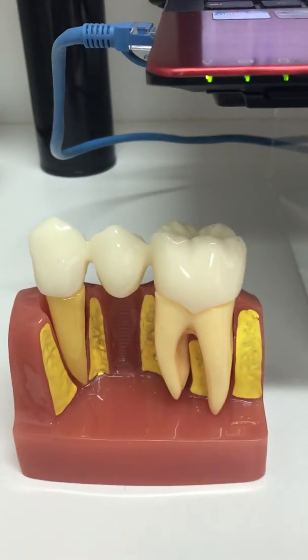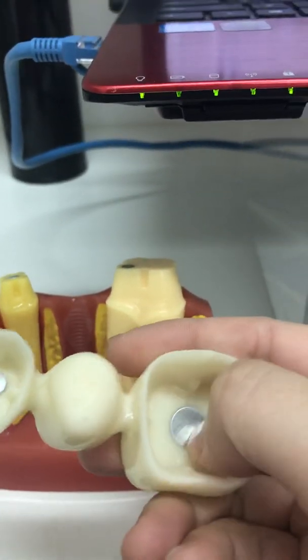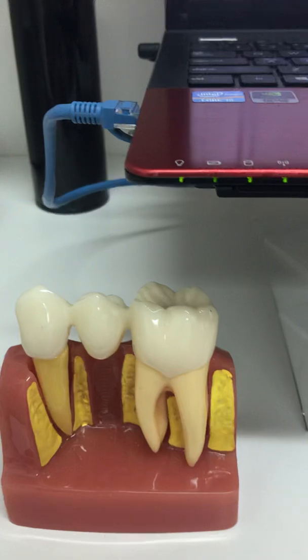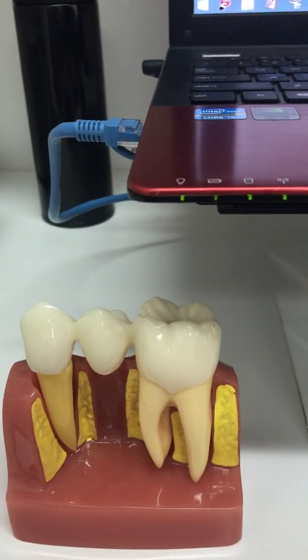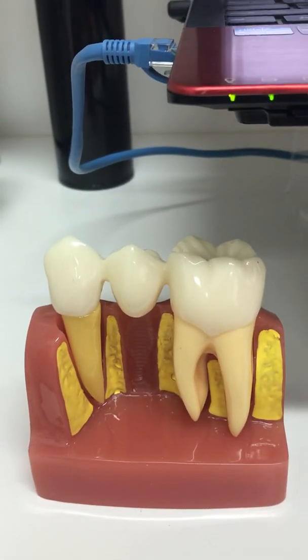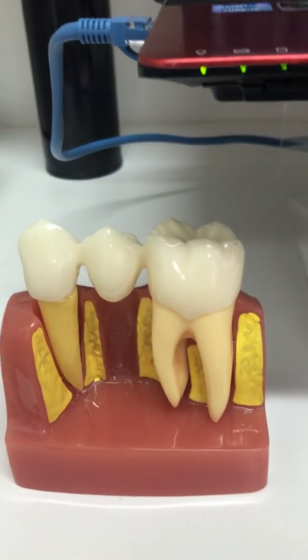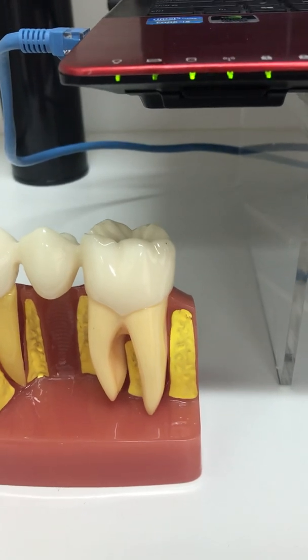Last but not least is a porcelain fused to metal crown, which you would typically see metal covering on the inside. The entire inside can be metal or gold, so it can be made of non-precious metal or precious metal. The method to cement them is a little bit different.